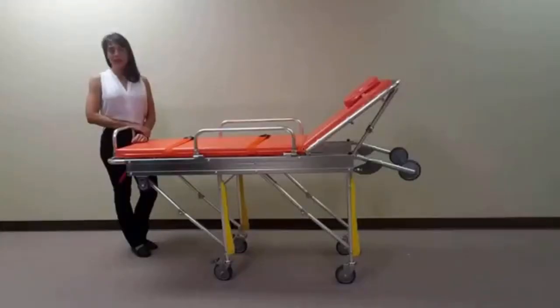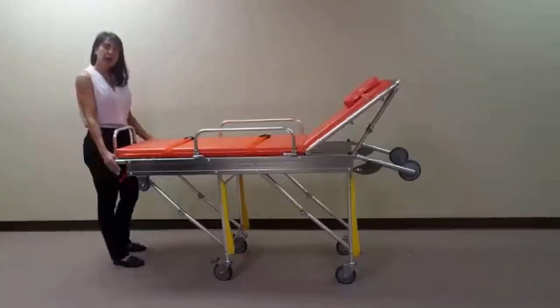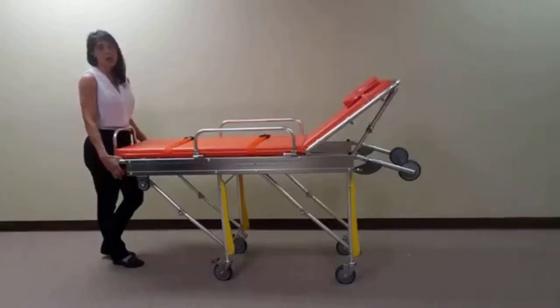To avoid accidental collapse, this stretcher is equipped with a locking lever located at the foot end of the stretcher. Simply turn the lever down or perpendicular to lock, or up and horizontal to unlock the collapsing mechanism. To adjust the height, simultaneously squeeze both red levers located at the foot end of the stretcher and slowly lower the unit into the collapsed position.